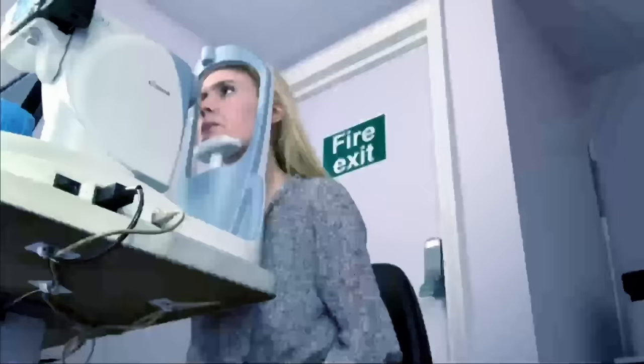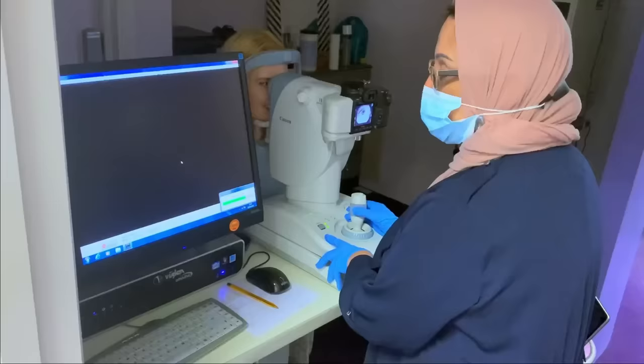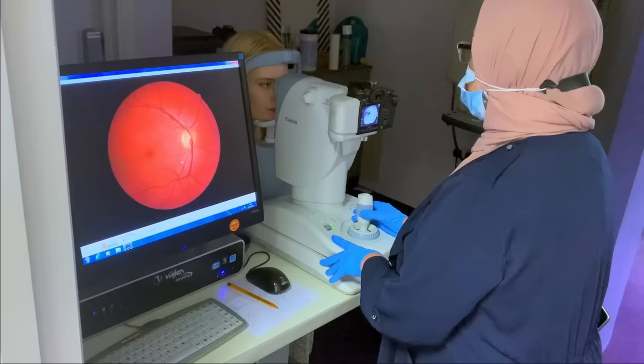So we're going to now take an actual image of the back of the eye. I'm just going to enter your details in. Keep looking at the green dot for me. Keep very still. I'm literally just going to flash some light on. Did you feel that? It is bright, isn't it? Beautiful image, that's lovely.